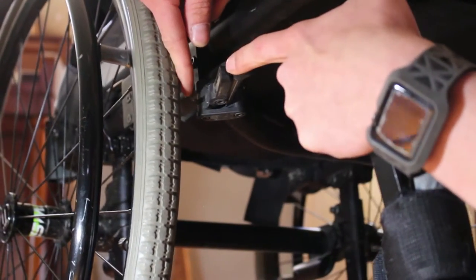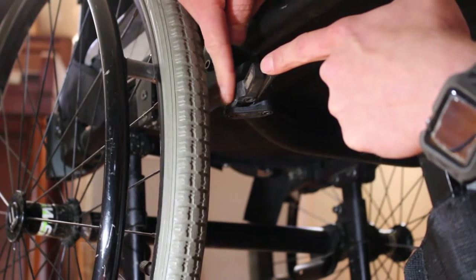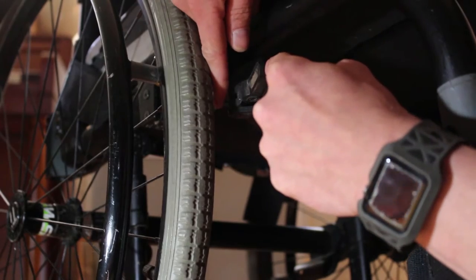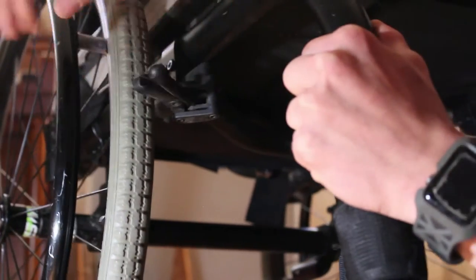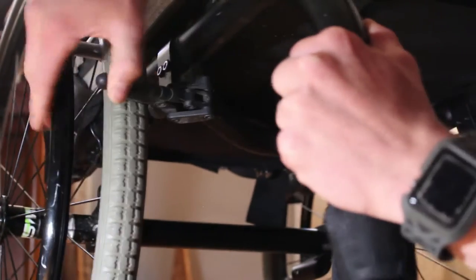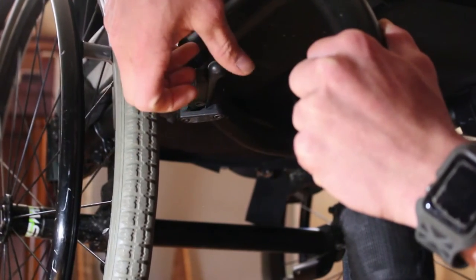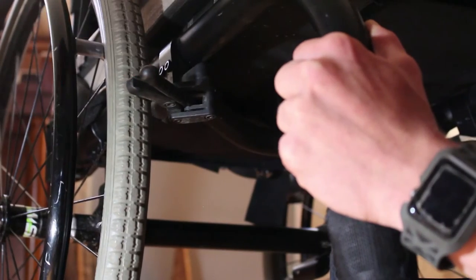Inside the brake there's a little spring right here. When it becomes loose like this where you can just move it around, that's when you know that it's broken. Once that breaks, the brake doesn't want to snap back. So what happens is, after you unlock your brake and you're rolling, it just comes out and drags and you hit your thumb. I've broken so many nails.